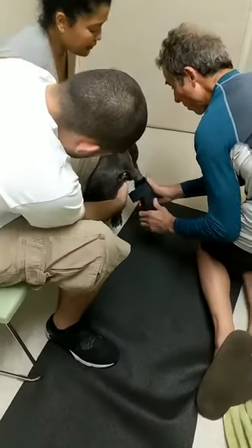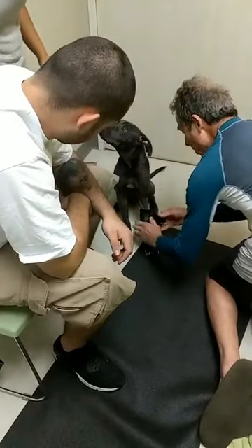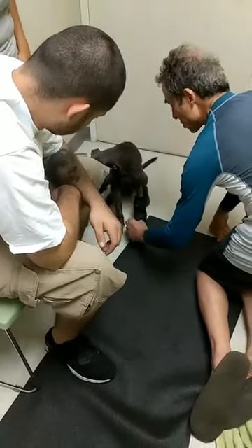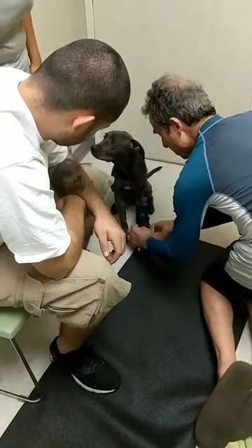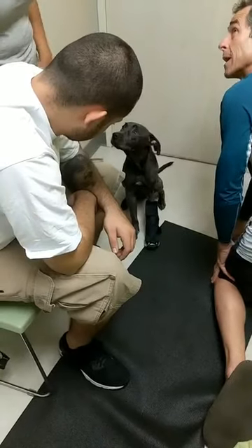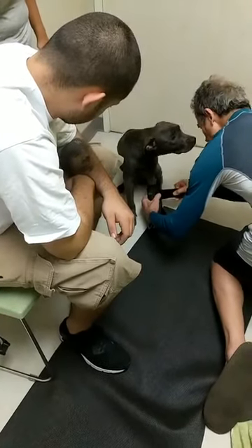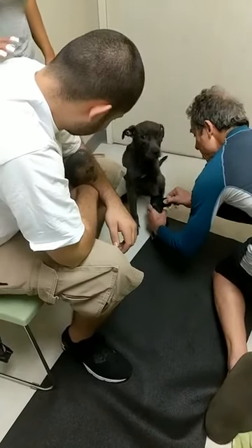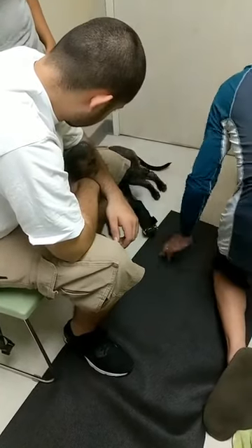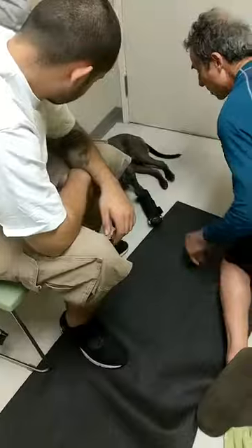As he continues to grow, he gets a little more matted. So these you can cut off — this is just excess, you can lose that. There's not as much stuff flopping around and nothing for him to bite. So you've got all this coverage here with the velcro, and you can just trim that. There are instructions from them, and you know where we live.